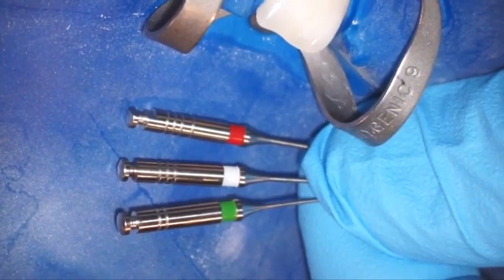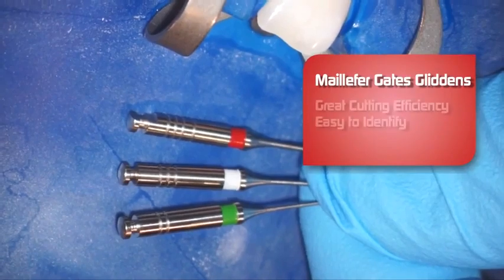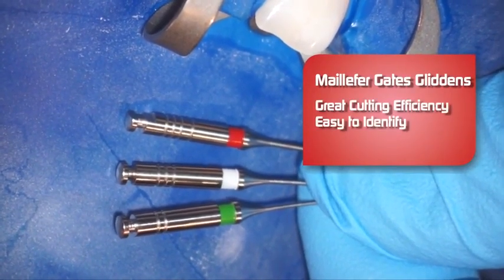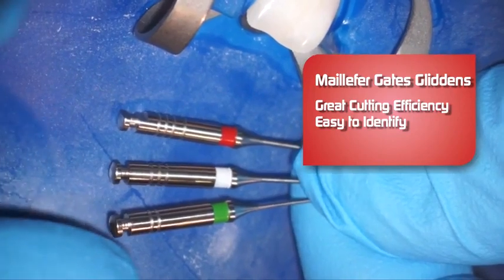Now we're going to introduce Gates Glidden burrs into the tooth here. We're going to be using the Dentsply Maillefer Gates Glidden burrs. What I really like about these burrs is their cutting efficiency — they're very easy to identify.